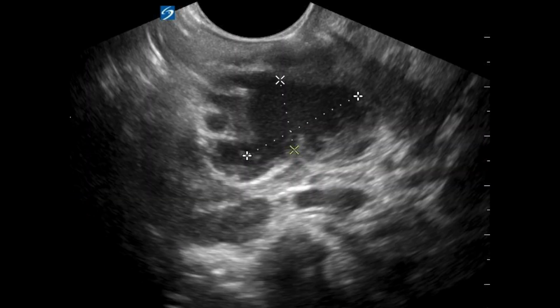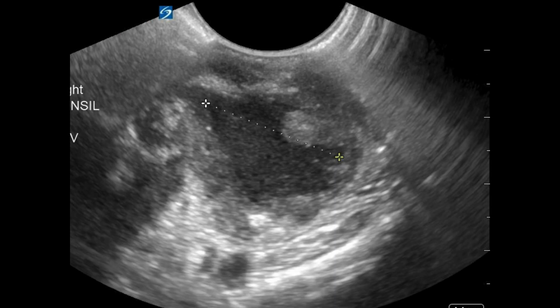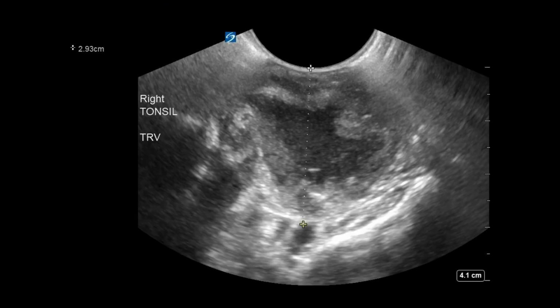You can measure it so you can get an idea of the volume of it and how much you're going to get, right? If I'm measuring out this tiny little abscess, it's a milliliter, that's going to be hard for me to hit. There's not much to get out of that. Versus if you're like, hey, this thing is 3 centimeters by 2 centimeters and it's got a ton of liquid in it, okay, well that should be pretty easy to hit, and there's something probably worth going after.